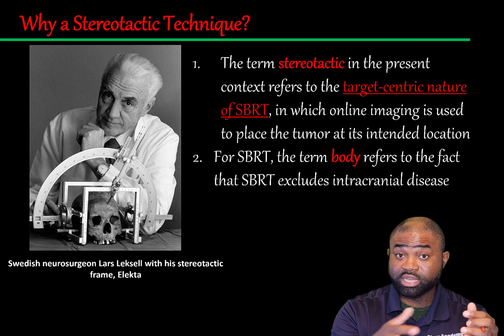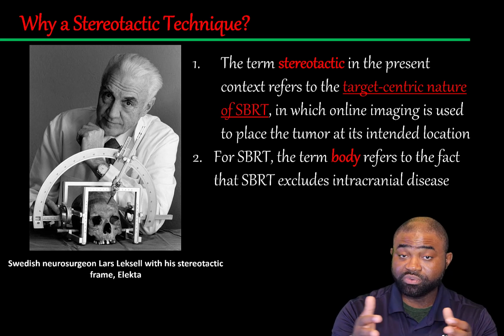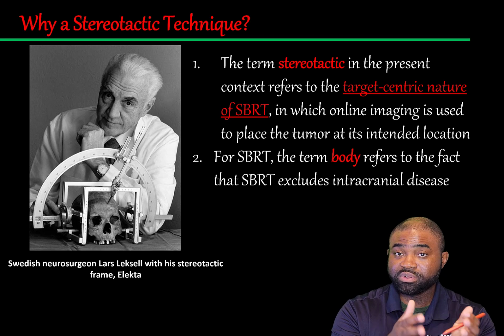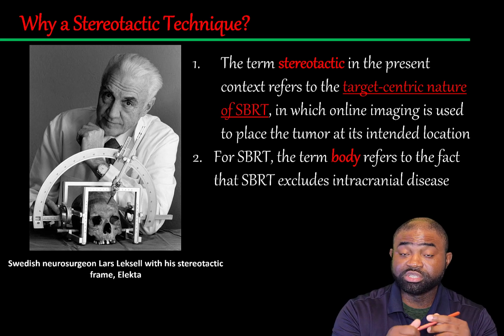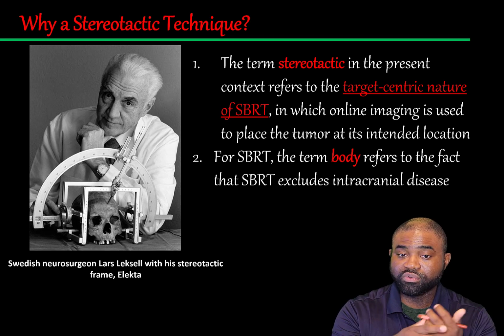With regards to SBRT, when we use the word body in this context, it simply implies that we are dealing with lesions or targets outside of the brain, that is, extracranial targets. But sometimes the phrase stereotactic radiosurgery is used for spinal cases, I guess because the spine is part of the central nervous system, which is connected to the brain. So you need to watch out for how the term is used interchangeably.